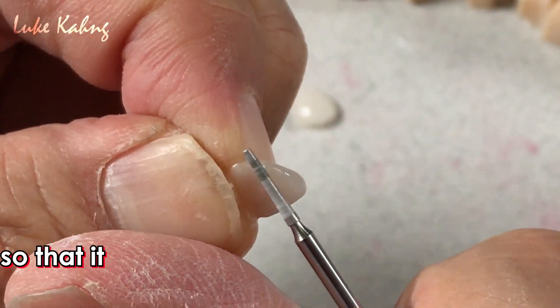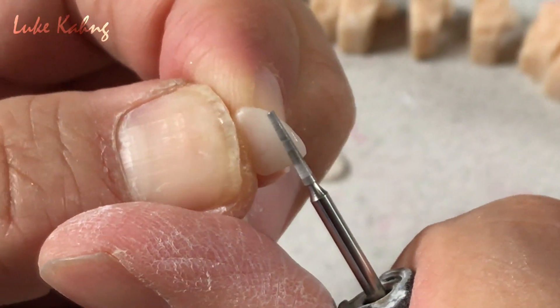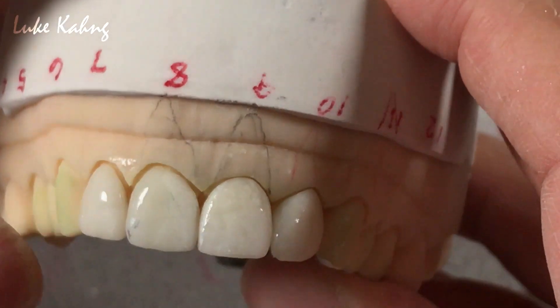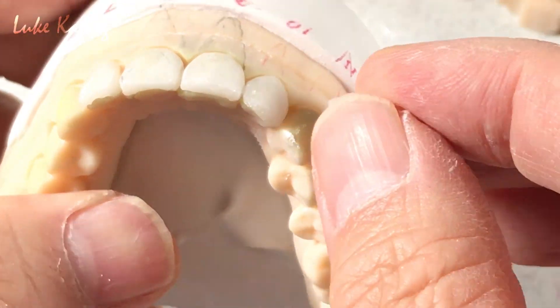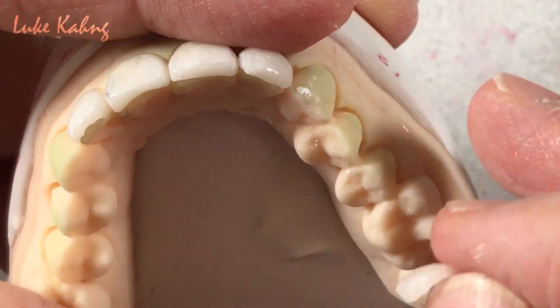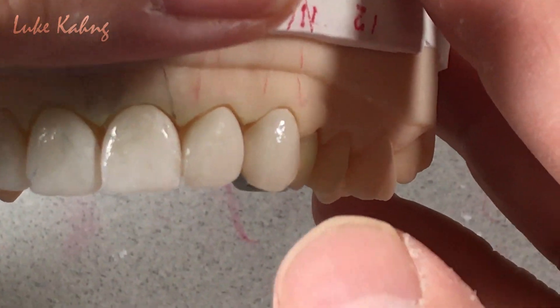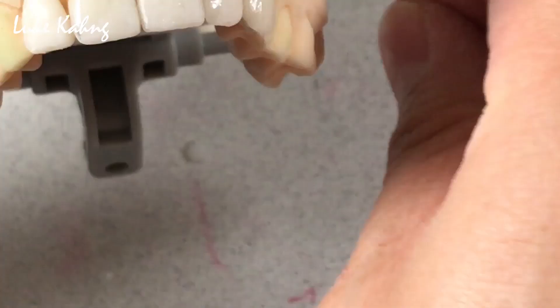All the time, hydrate it — otherwise the veneer will get cracked. So now I try this. It's better. Now, K9 — same contour. The problem is this: because of this, I cannot make it shorter. So after bonding, the doctor can trim it. It should be okay after cemented.